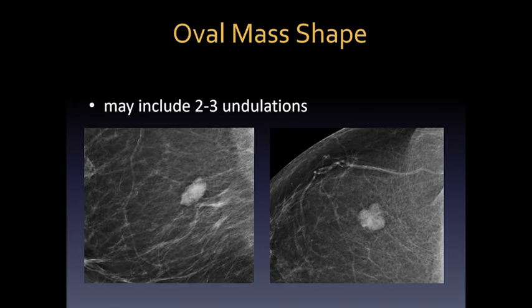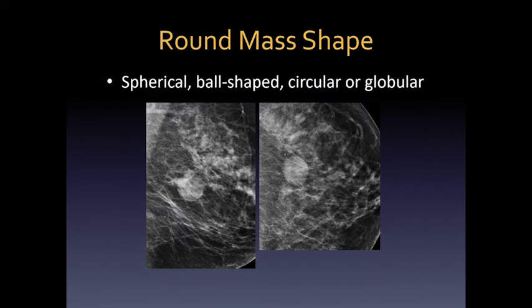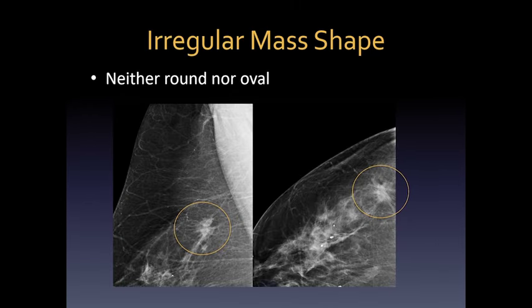Here is a characteristic oval mass with about three smooth undulations — it looks very benign. Here, on the other hand, is a round mass defined as spherical, ball-shaped, circular, or globular. We have to be concerned it could represent a cyst but must investigate further. An irregular-shaped mass is neither round nor oval — here is an example of one that is very suspicious for malignancy.